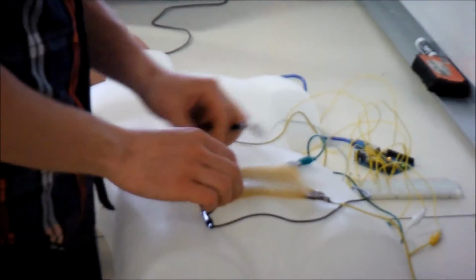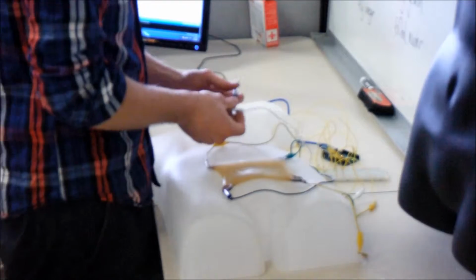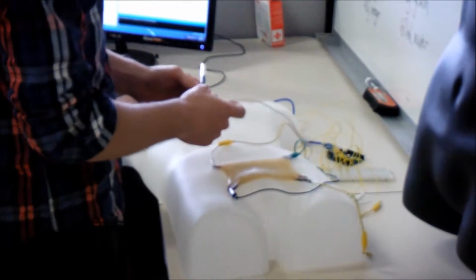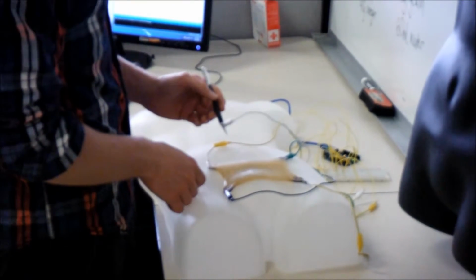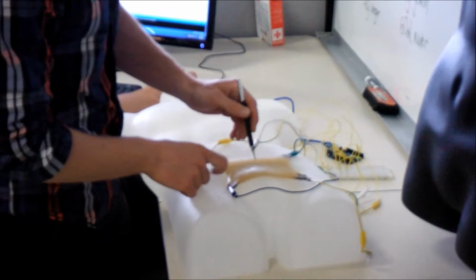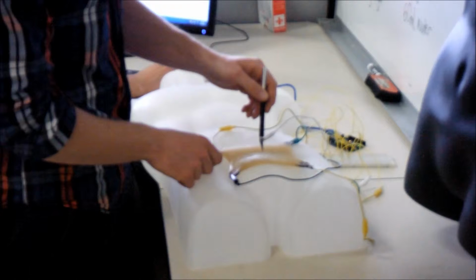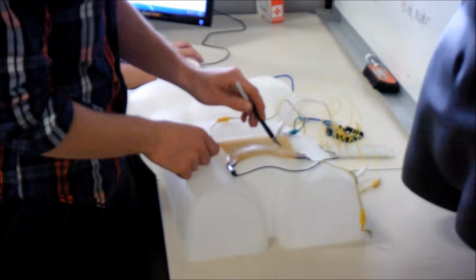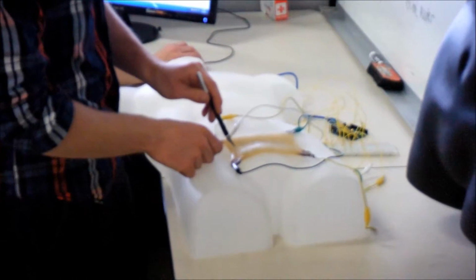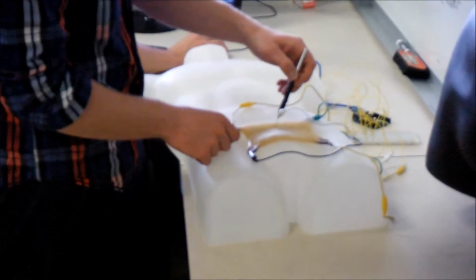We have 4 probes on the plastic connected to the Arduino board. And then the Arduino is connected to the computer, which is then going to plot wherever the tool is going to be. So there's a scalpel, place it in the middle, you get a result, and then as we move it, you can see that the tool is tracked in the computer.